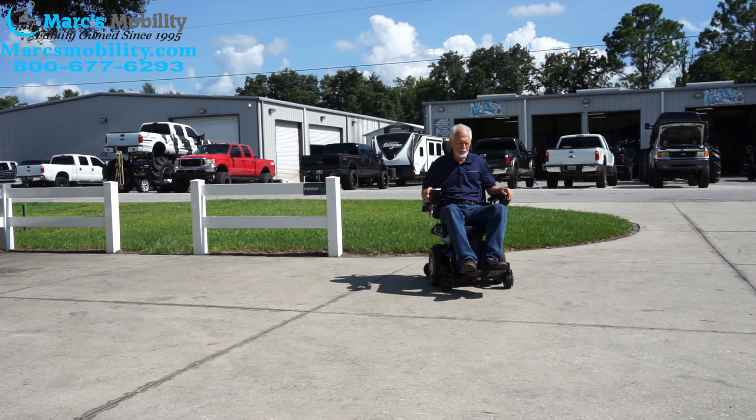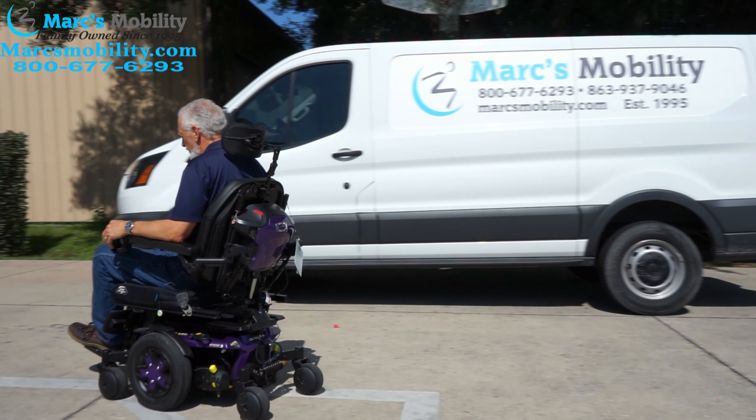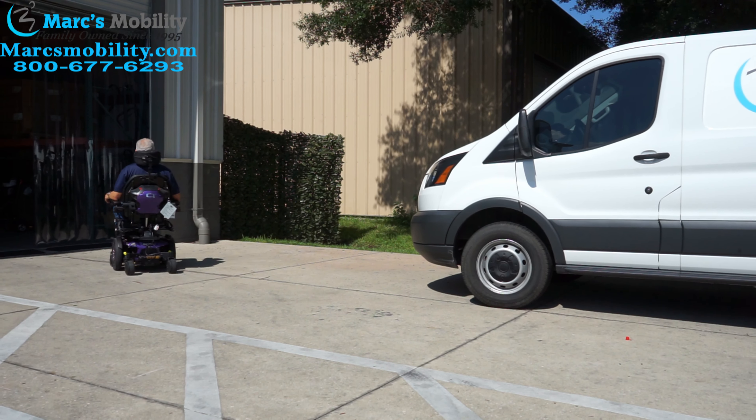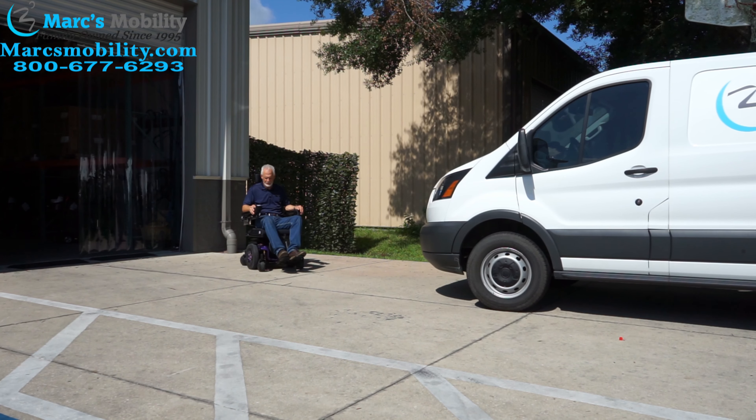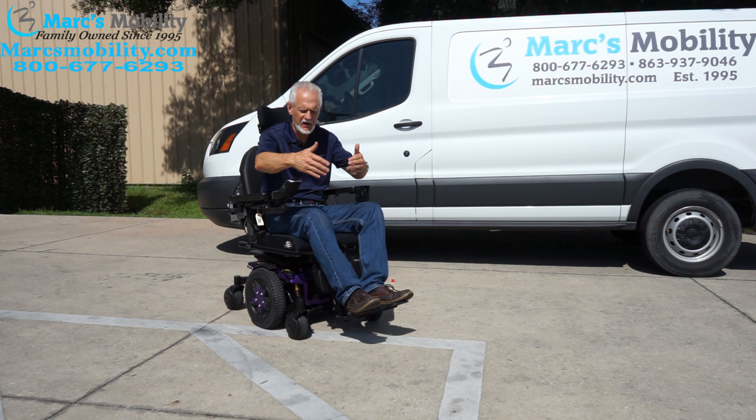These chairs are really fast — 6.1 miles an hour, maybe a little faster, but it shows 6.1 miles an hour. Very easy to drive and they brake automatically. Basically when you let go, within a few feet it stops.